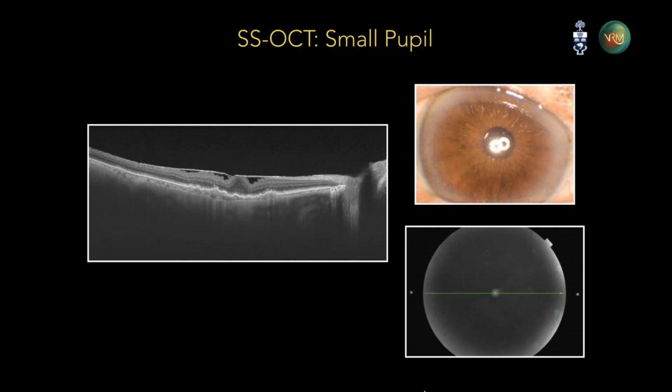I can tell you in our practice, we went from doing our injection clinic with patients getting dilated, then getting OCT'd, and then getting injected because they were having a spectral domain OCT, to not getting dilated, which saved us 15 minutes per patient at about 35 to 40 patients per session. I'll let you add that up. That really added to a considerable amount of time per patient.